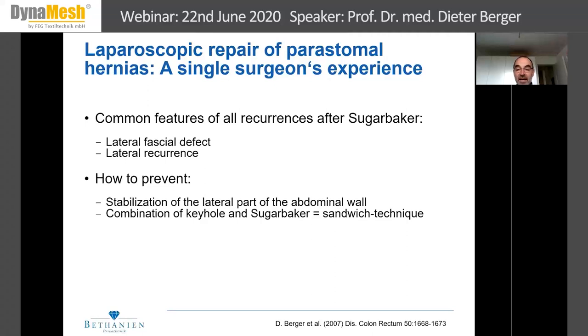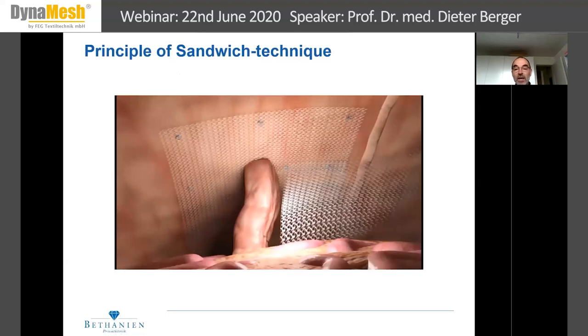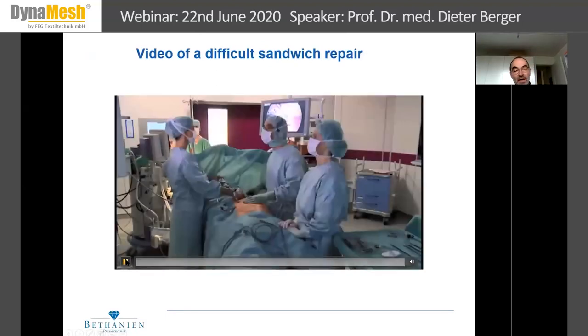In fact, this technique was described in the late 90s by a German surgeon, Dr. Berliner from Berlin Buch. I was not aware of that description when I first did the sandwich technique by myself, because until that point, I really did not recognize what he really did. This is an animation showing the stoma loop, the midline incision, the keyhole mesh, which is closed by non-resorbable tacks or sutures, and the bigger Sugarbaker mesh covering not only the midline but also lateralizing the stoma loop.